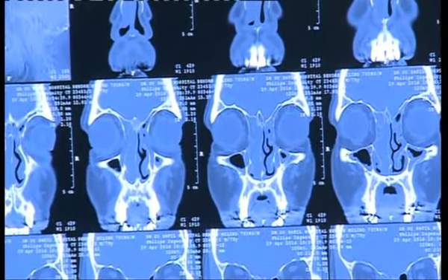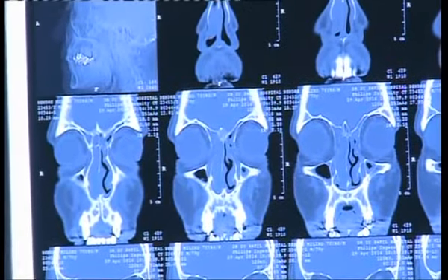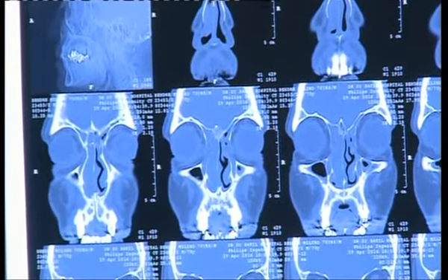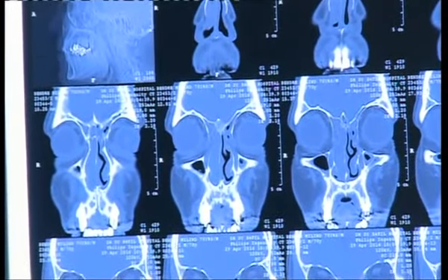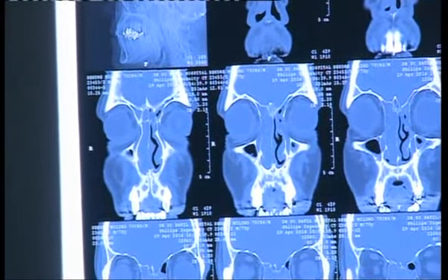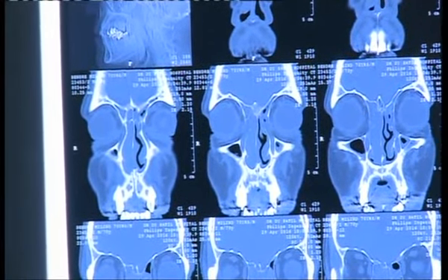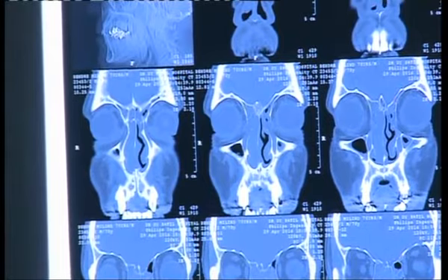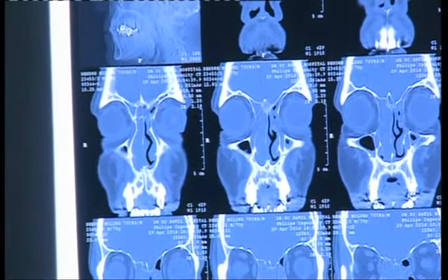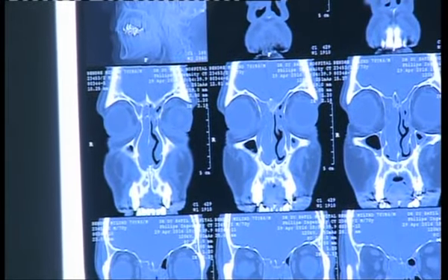Satish: if the supraorbital cell is well pneumatized, is it that the anteroethmoidal artery will be hanging from a mesentery? Could be. I mentioned that if there is too much pneumatization at the anteroethmoidal skull base, the bone is going to be thin, and that affects how the anteroethmoidal artery courses through the thickness of the anterior skull base. If the skull base is thin, the artery is going to be prominent. If it is too thin, it may be in the mesentery, uncovered by any bone.